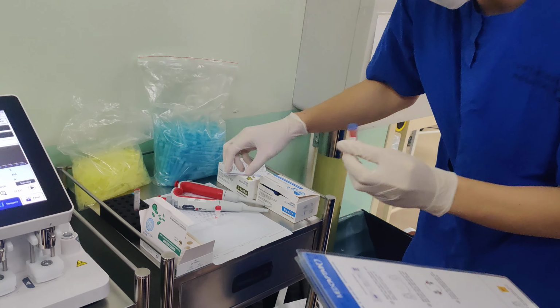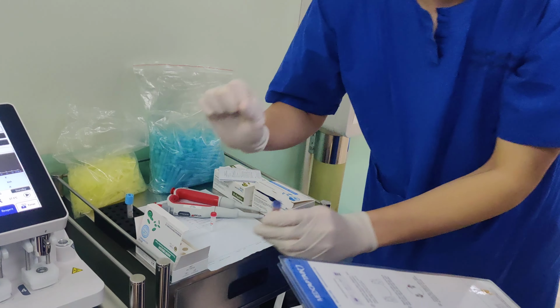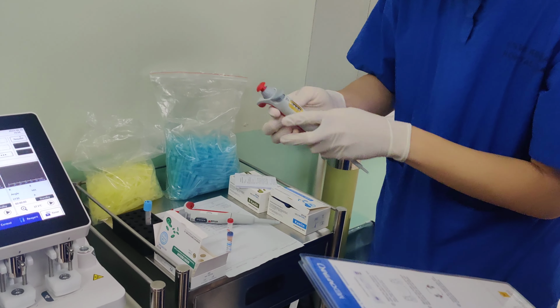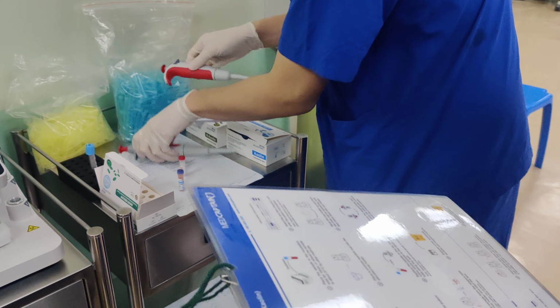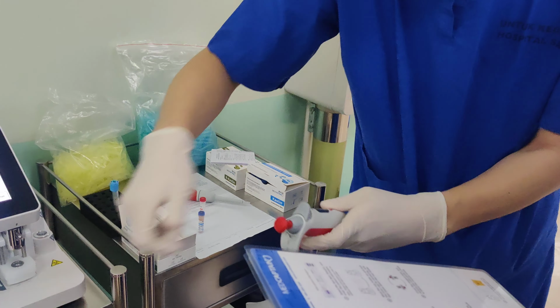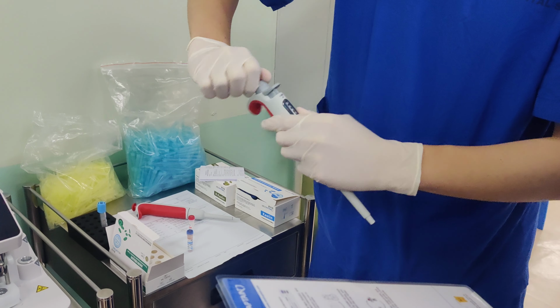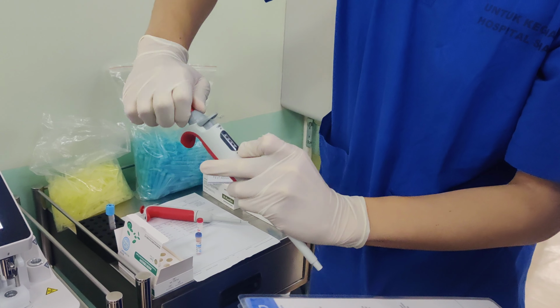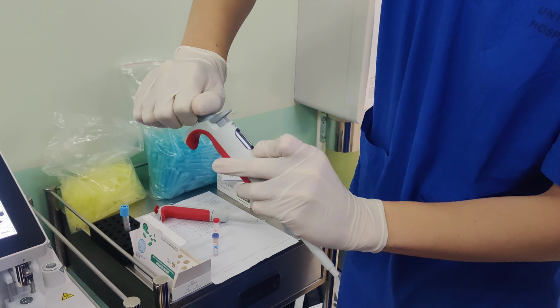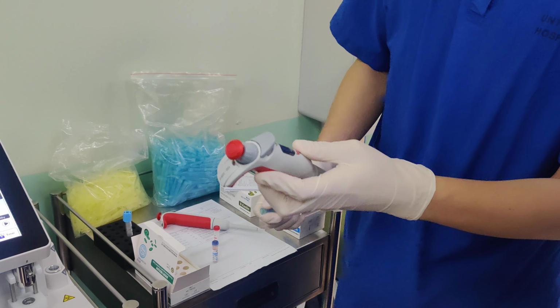Then we come to the final step already, which is to add this mixture into the cup containing the trigger, which is calcium. For this step, it will be 340. Transfer 340 of the blood sample in this to that. So now we set that up to 340. Like I said, to adjust, we just spin the grey one. So 340, and then we use another new tip because the old one was containing the fresh blood.